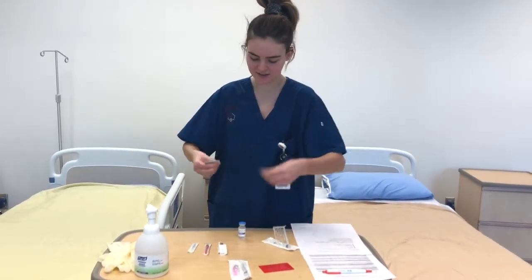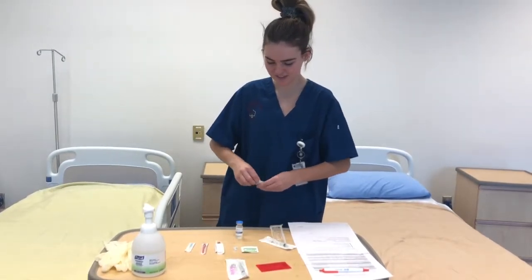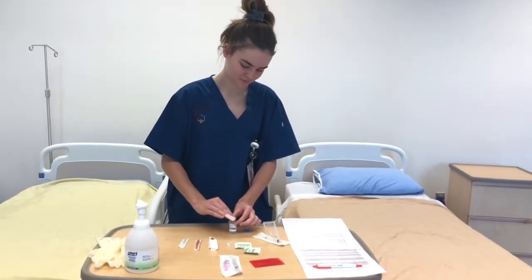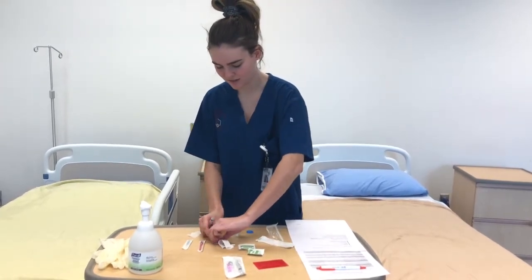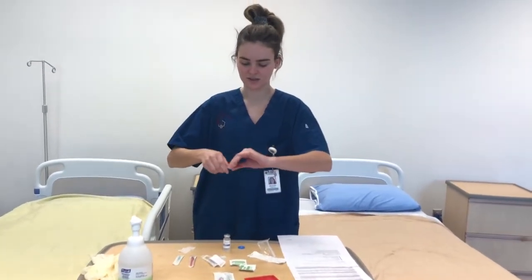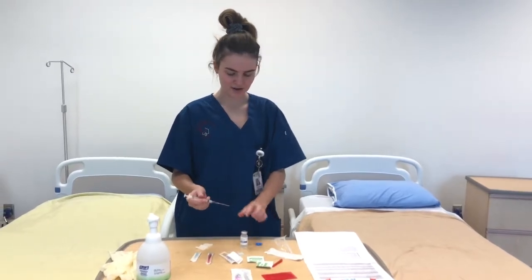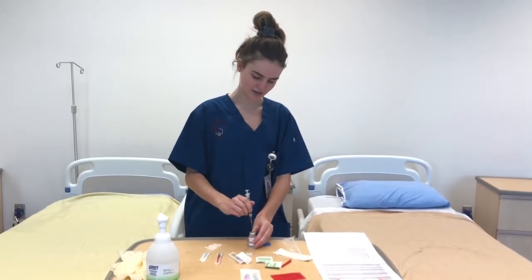So I'm going to use a sanitizing strip to sanitize the lid of the vial cap before injecting into it. So once that's done, I can take the syringe and the needle, and then I will just luer lock it into the needle like that and pull off the lid carefully without getting a needle injury. So now that the vial is clean and I have my blunt tip needle, I'm going to puncture a site into the vial.